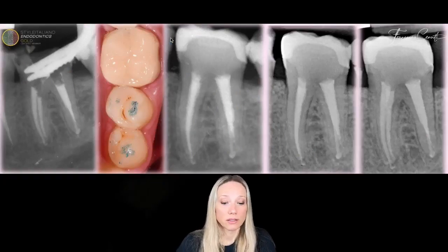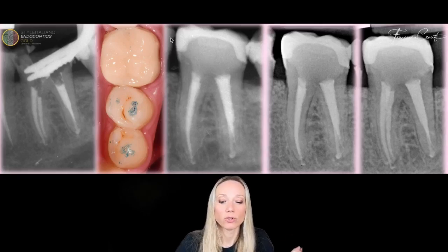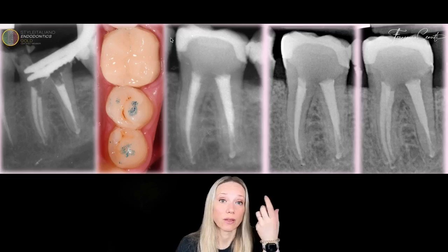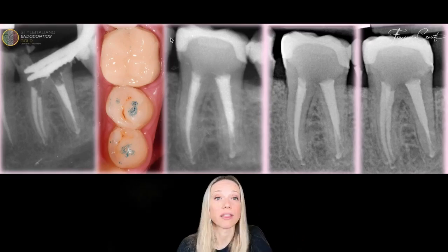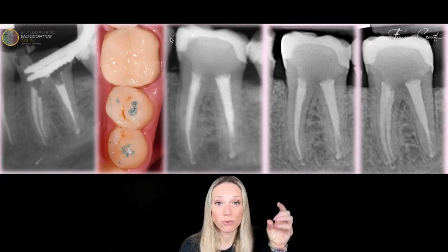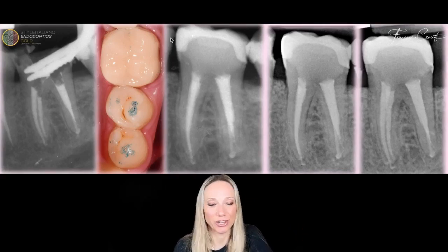And you see that in the distal root there is a deep split that I was not able to shape with my files, but just cleaned and filled. And what else do you see? That in the coronal part of this tooth there is a huge taper preparation because there was a post inside. So in this case there was nothing I could do to be conservative. I did what I could, but the coronal part of the tooth had been altered before. So in this case we just have to adapt to the situation.